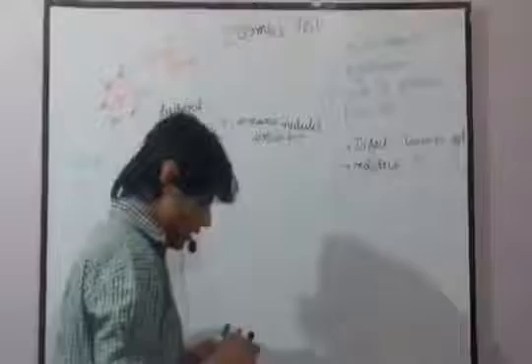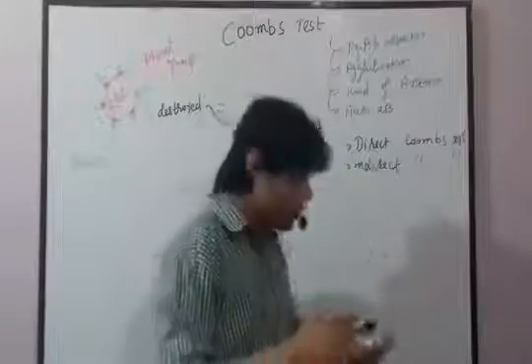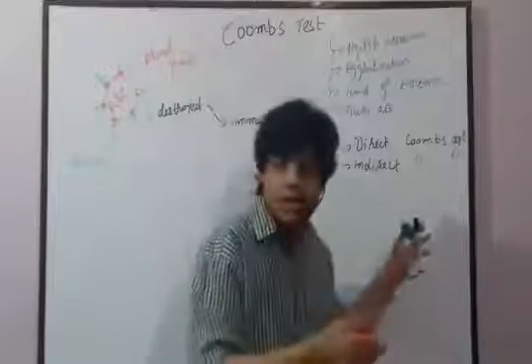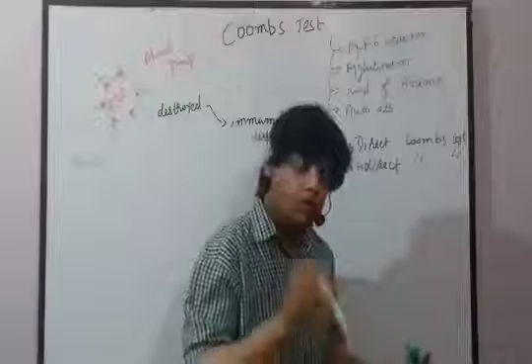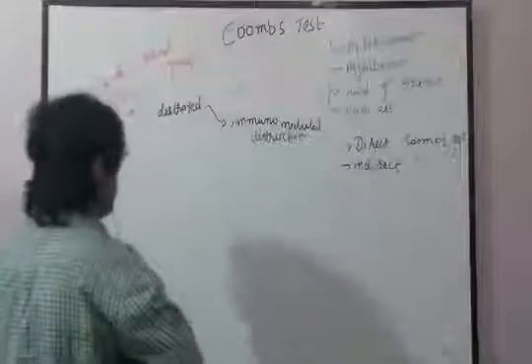Direct Coombs test, indirect Coombs test. Now one important thing that I forgot to mention is about the Coombs reagents. Before going to explain the direct and indirect Coombs test, first of all you need to understand about the Coombs reagents. Now what is Coombs reagent?